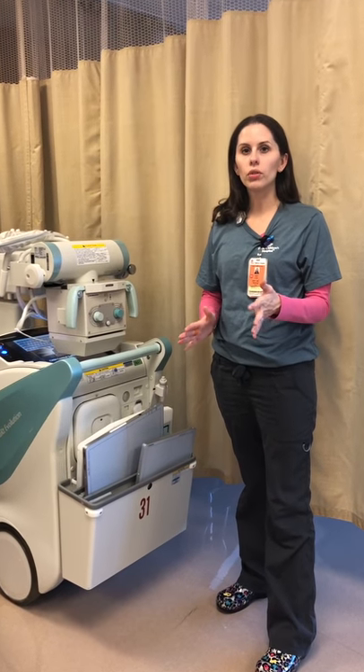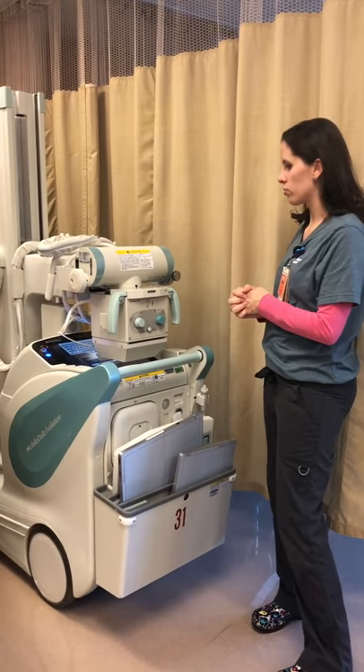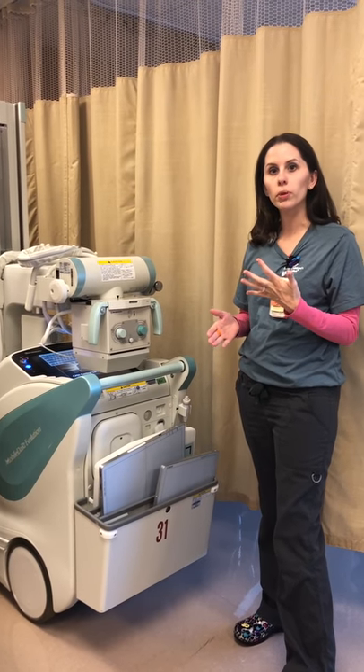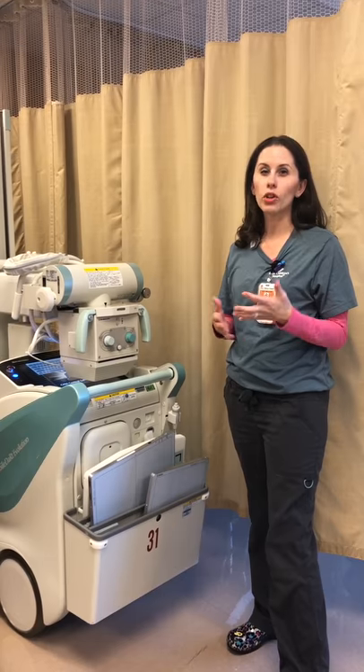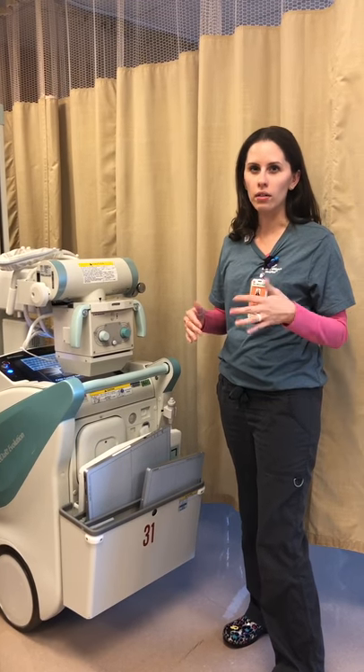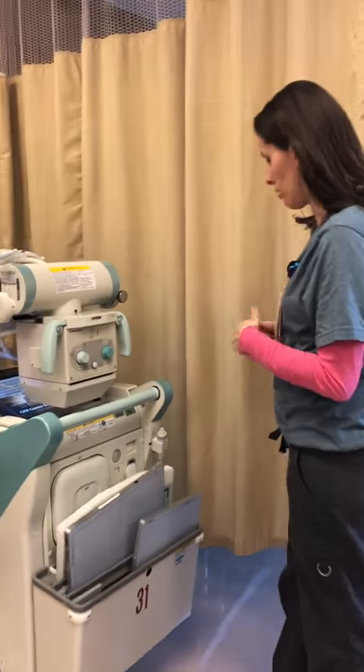I'm going to show you a quick overview of the Shimadzu portable — some tips and tricks that might help you work with the portable itself, and also what you can use when you're in a tight space and can't really get around, but you still have full functionality of the machine itself.